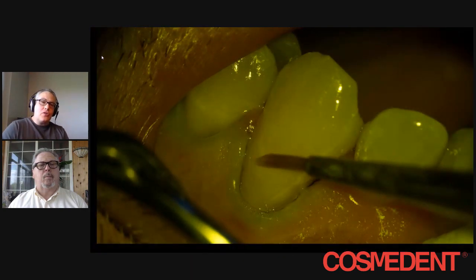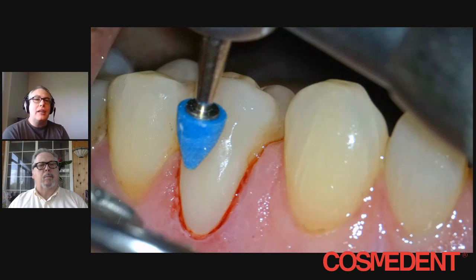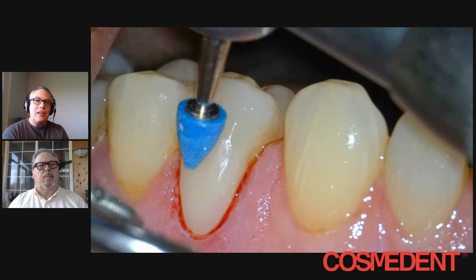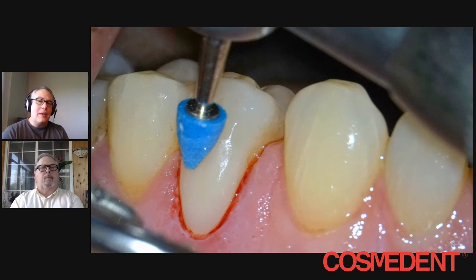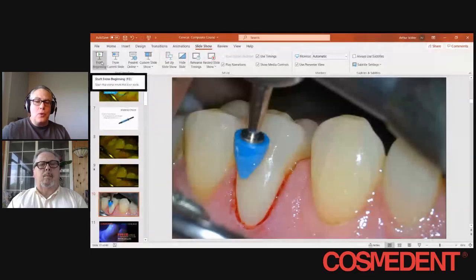Place it over and make sure that you've sufficiently opaqued it. Then what I want to talk about in part two is, once you've placed your composite and cured everything, what is the best way we can use the fantastic properties of a microfill composite to best get the outcome that we want?